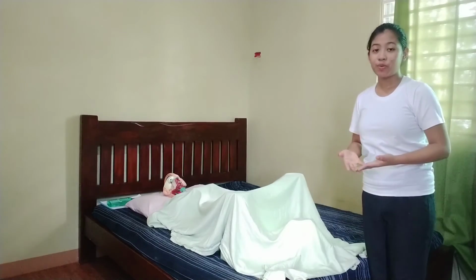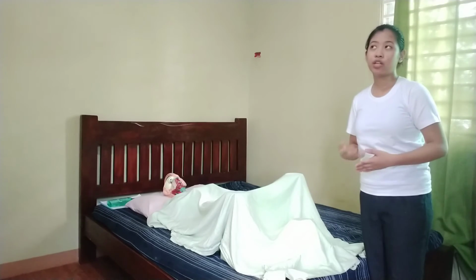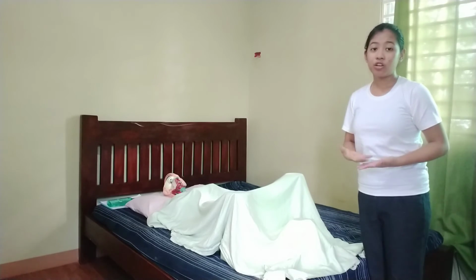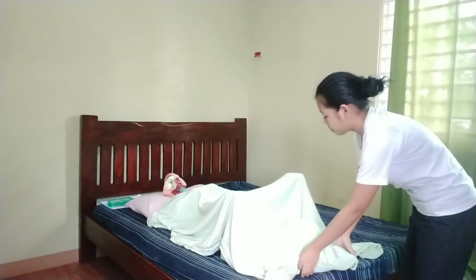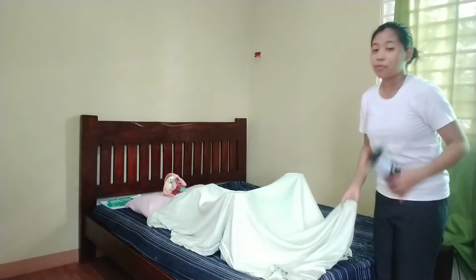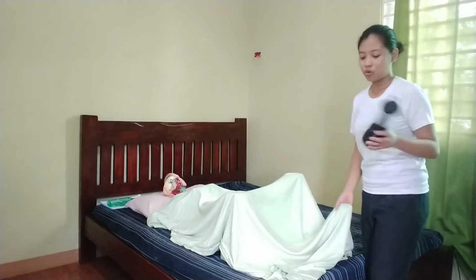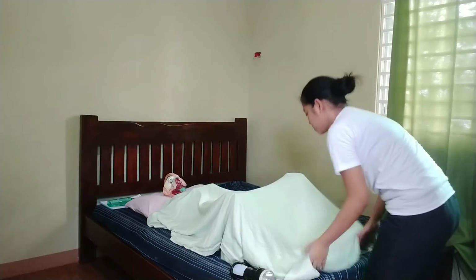Assuming that 15 minutes have already passed, we will now remove the Perilite, or the heat lamp. We can also do the procedure for about 20 minutes, depending on the physician's orders. So, I will now remove the Perilite, ma'am. When we remove it, make sure to check the patient's perineal area again for any untoward reactions. Everything seems to be normal.